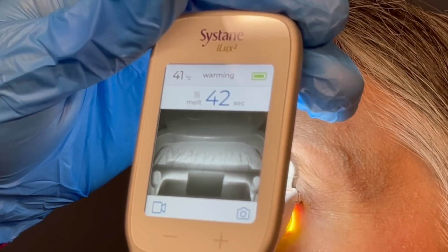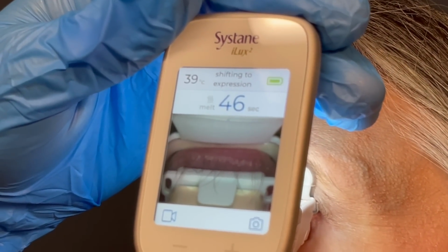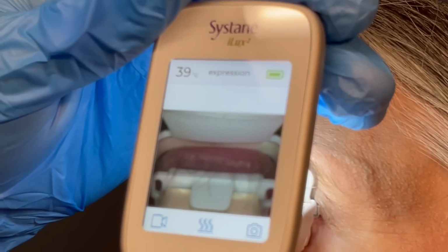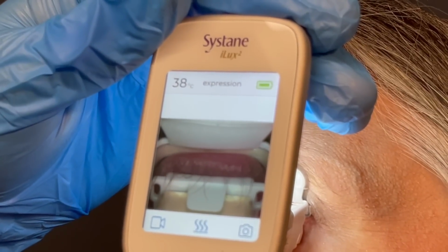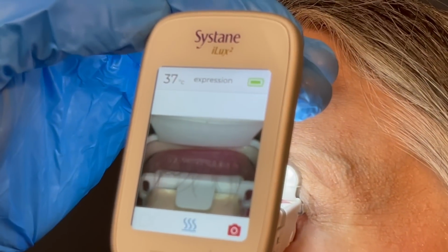And that's 40 seconds in, so now we are just going to push all that nice golden oil to the surface and really get things producing. There's a lot of good oil glands pushing to the surface right there. Get a picture of that. I'll get rid of that. Is that one a little forceful? No. It wasn't? Okay. There was a ton of good oil coming to the surface on that one. Really? Yes. Good olive oil too. Nice. Will that promote more? Mm-hmm. It'll promote a lot more.